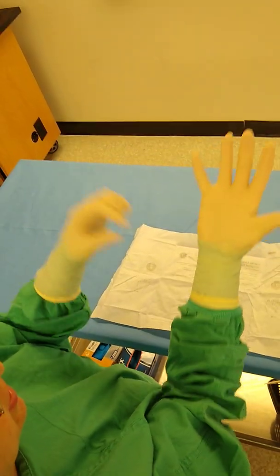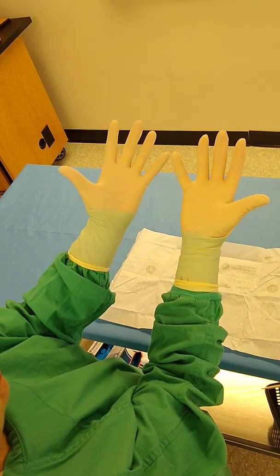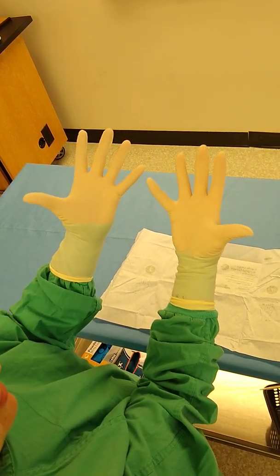All right, if you accidentally pull your cuff out, you have to start over. If you rip your gloves, you have to start over also.